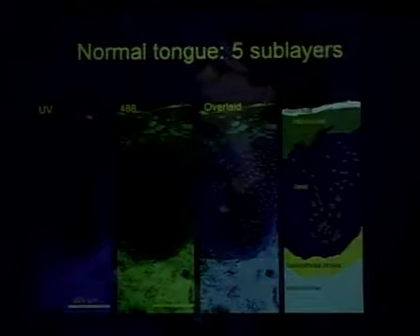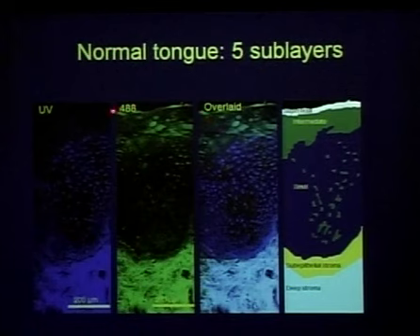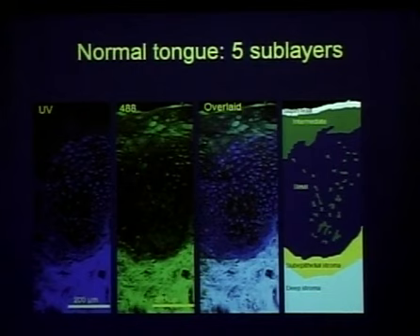So let's take a look now at what happens as we begin to look at abnormal tissues. And we found it useful, in trying to understand what was happening, to divide the tissue into layers. And so I talked about the epithelium and the stroma. But within the epithelium, we observed sometimes a very thin superficial layer of keratin, even in these traditionally non-keratinized sites.